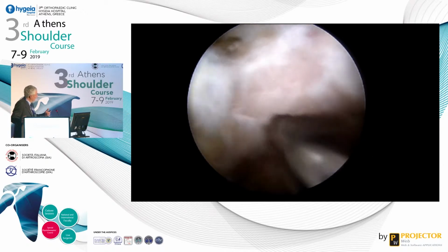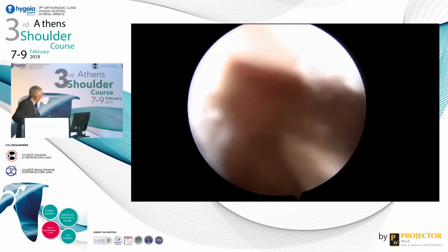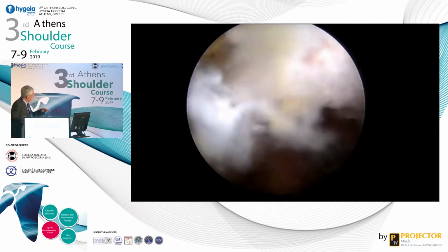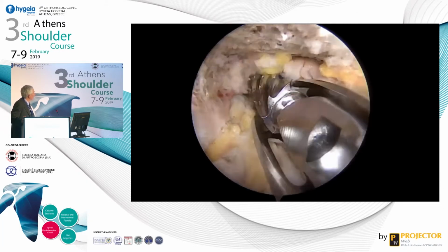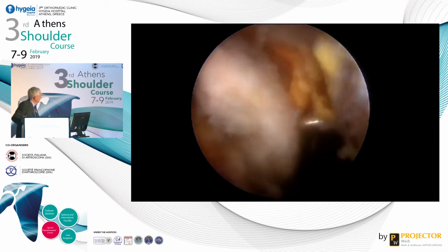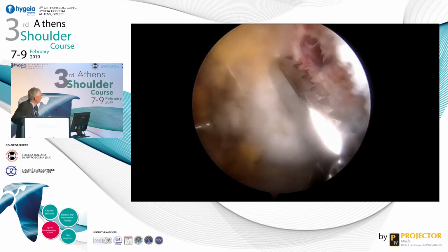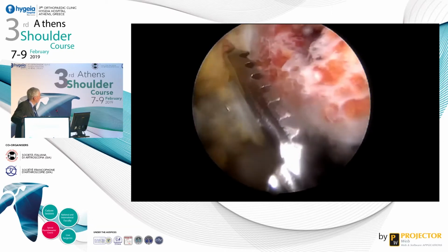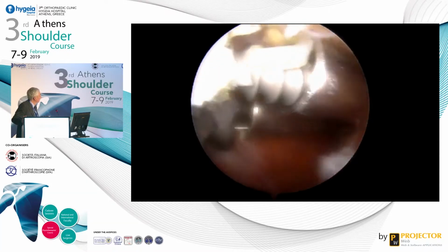And after, you put the K-wire through the subscapularis split to the conjoint tendon. After that, you can prepare the coracoid process. With a rasp, you can make the coracoid process as flat as possible, especially proximally, and you have less bleeding than with a burr. After, you can cut it, you mobilize the coracoid process, and you fix it to the anterior guide with the two barrels. You fix the inferior hole of the coracoid process, and after that, it's definitely easy to finish the preparation of the coracoid process.